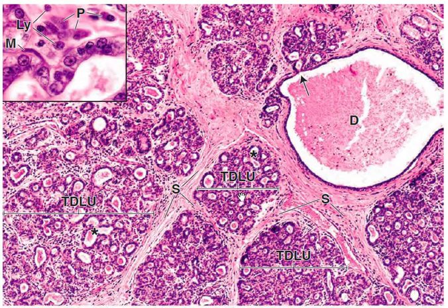The cells of both components are secretory, so the alveoli as well as the intralobular ducts consist of a single layer of cuboidal epithelial cells subtended by myoepithelial cells. Often what appear to be several alveoli are seen merging together with one another, like this right here. Such profiles represent alveolar units opening into a duct. So interlobular ducts here are easy to identify as they are surrounded by dense connective tissue. In one instance, an intralobular duct can be seen emptying into an interlobular duct. Again here.